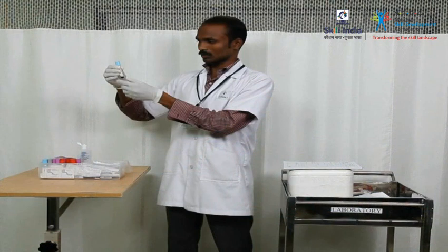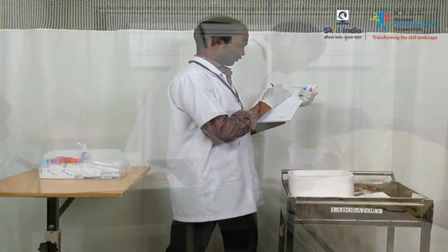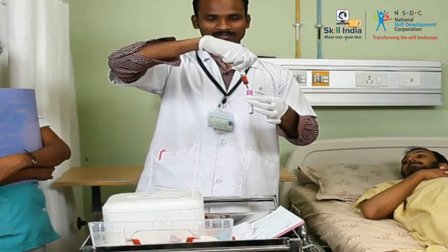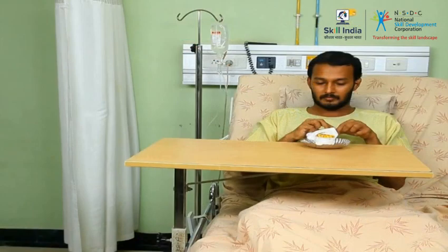It must be reconfirmed that the specimen that is being collected is the same as ordered by the doctor. Certain blood tests must be obtained at specific times. For example, the sample of blood collected to test the blood sugar levels should be done at least 2 hours after the patient has consumed any food.